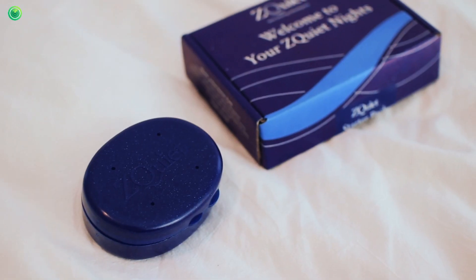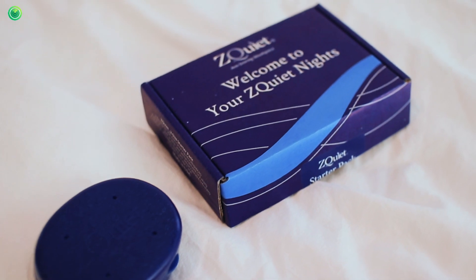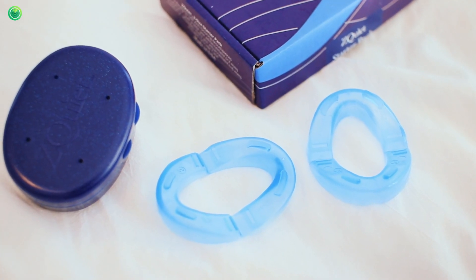So let's go ahead and open it up. On the inside you have these two pamphlets, and then you have the ZQuiet case. Inside it comes with two different size mouthpieces, so this is a great starter pack — you can see which size fits most comfortably, and it walks you through all of that in the instruction manual.